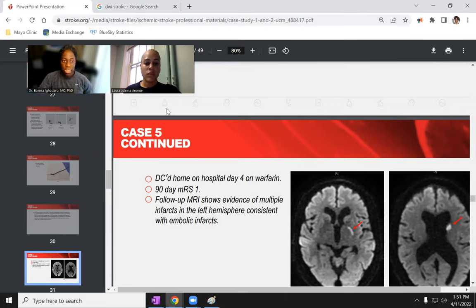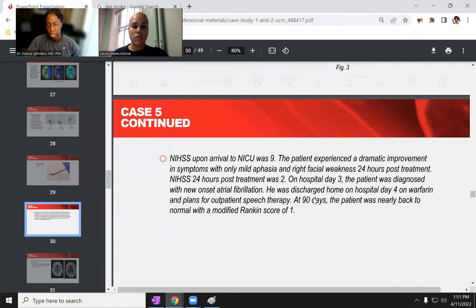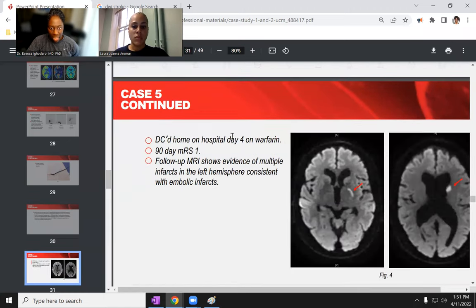and people recognizing stroke symptoms. Oh, look, they do show us the DWI. Is this it? Well, look at that. This is DWI. I see. So he's just got a little baby infarct. Yeah, he does. Lucky person.